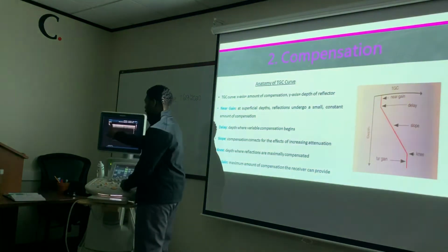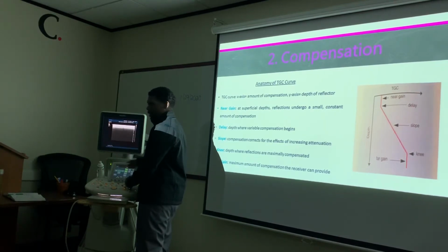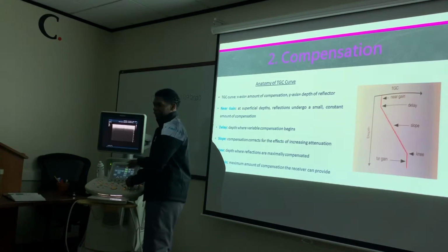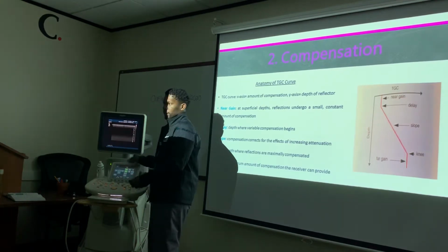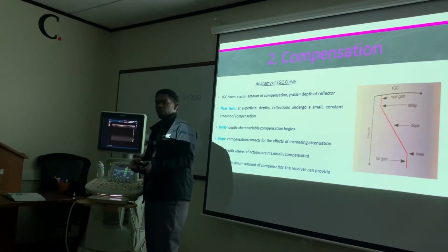Guys, I don't know if you know, but your 2D percentage is up here. Your amplification percentage is right there, 86%. See it moving? Now I'm at 100%. I'm at the maximum of my amplification. Okay? So that's how you can see how much you're adjusting your amplification or your receiver gain. It's a number on there that tells you. That's how you know everything that's going on with the machine.